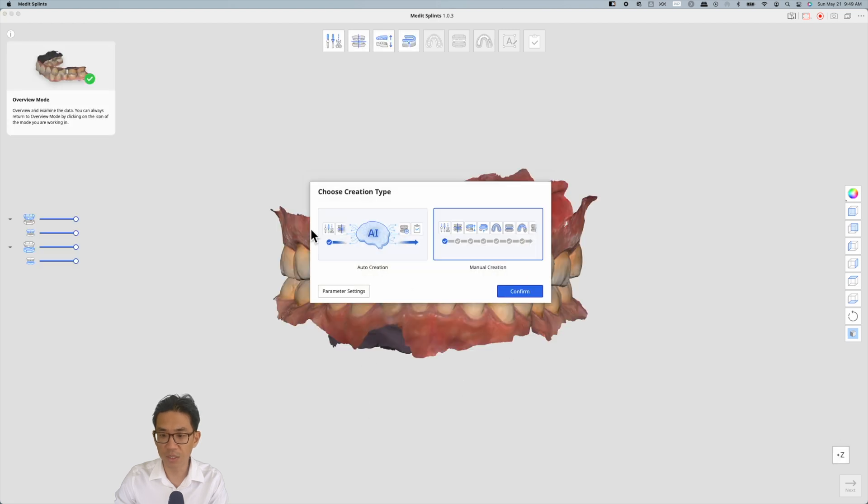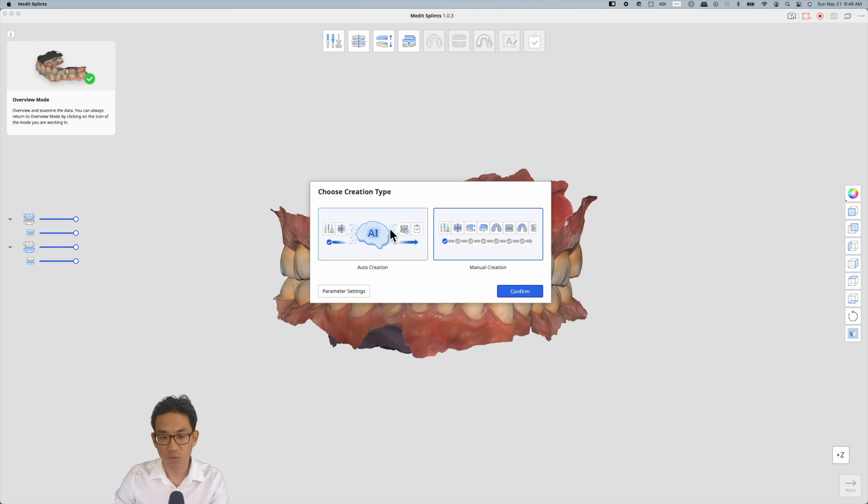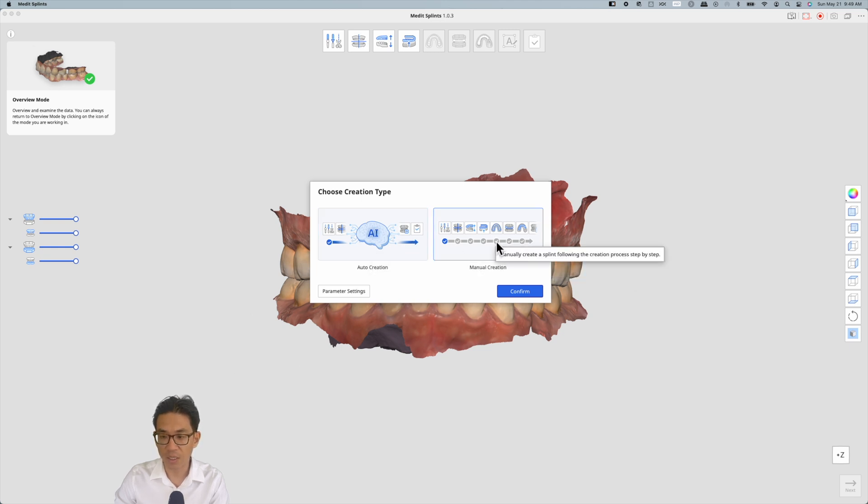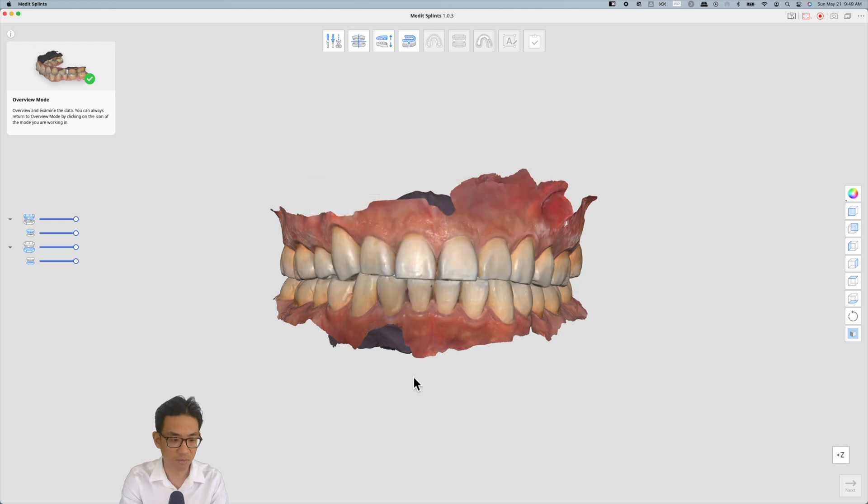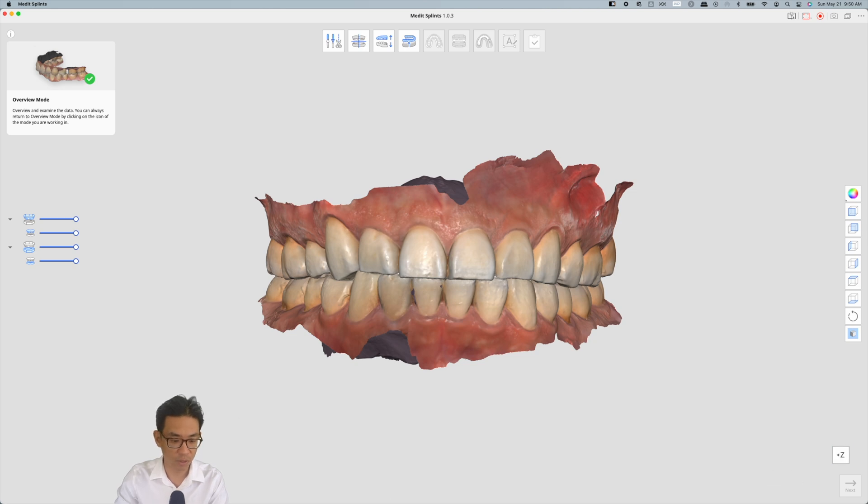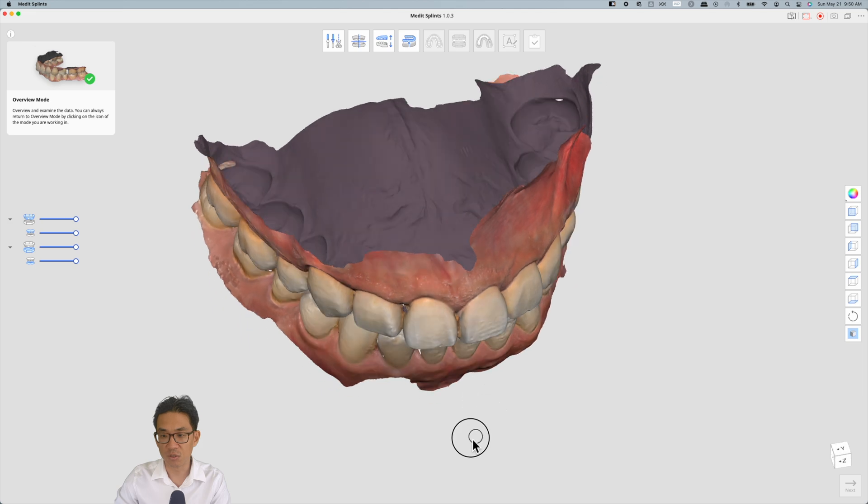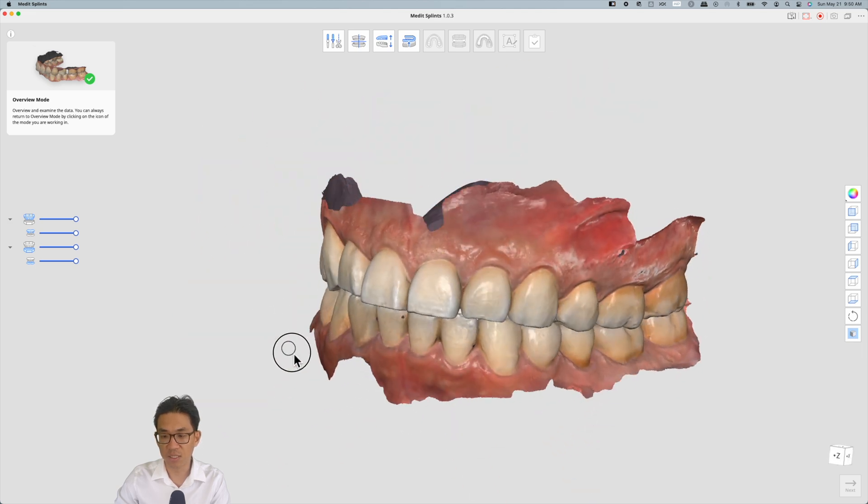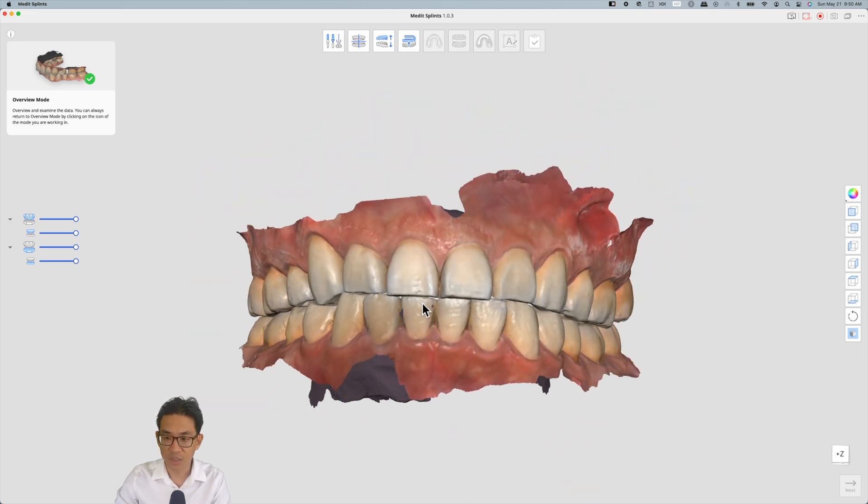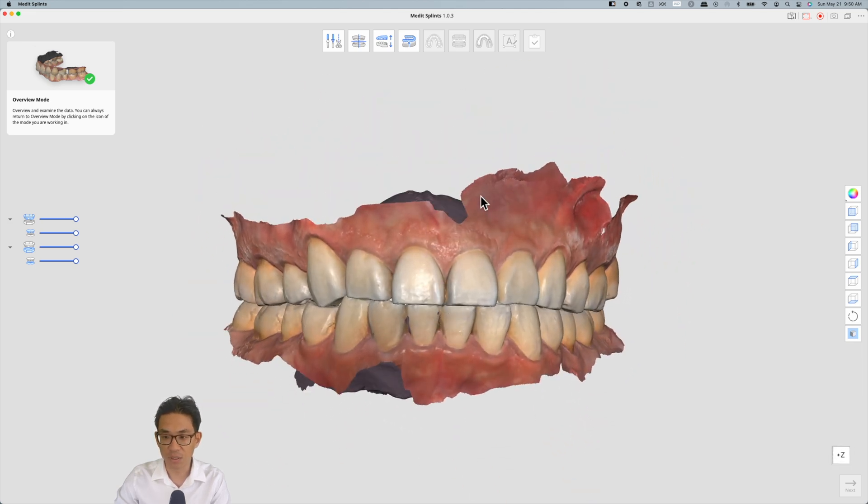You can use AI creation which I don't necessarily use. I like using manual creation just so that you can make minor adjustments if needed. Manual creation allows for just some tweaking of certain areas which I prefer. This allows you to view your scan data.